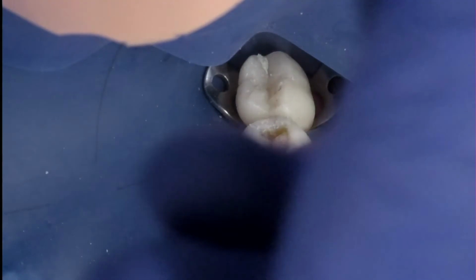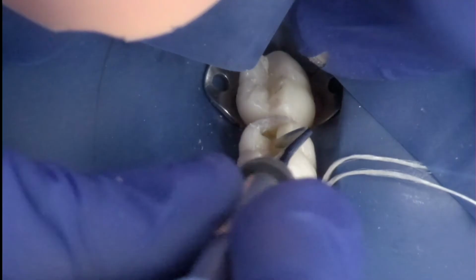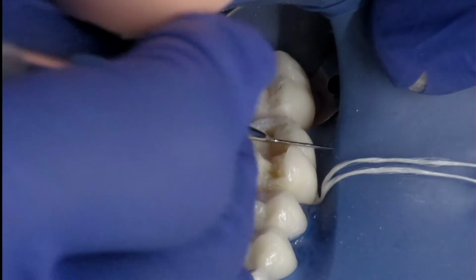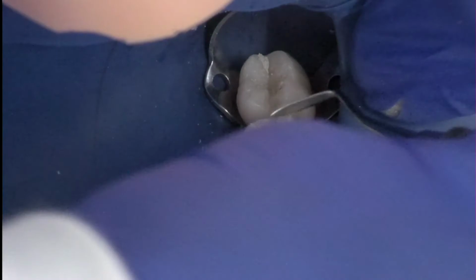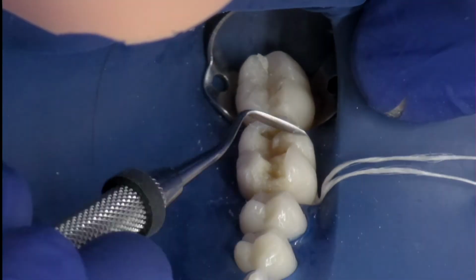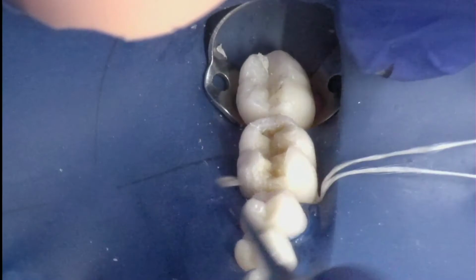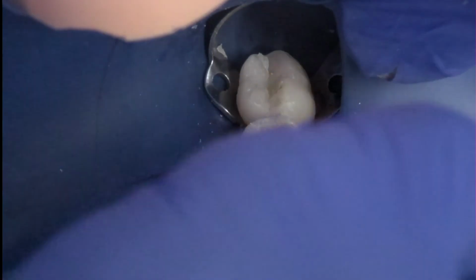If I could do this again, I wouldn't cure as much. I would try to build each cusp, add to each cusp before every cure session. Here I am adding enamel. At the end of this tooth, it ended up being too dark, so I should have maybe made a larger increment of enamel or made the second increment of A3 smaller. I'm not sure exactly where I would change that, but I definitely would change it for the future.